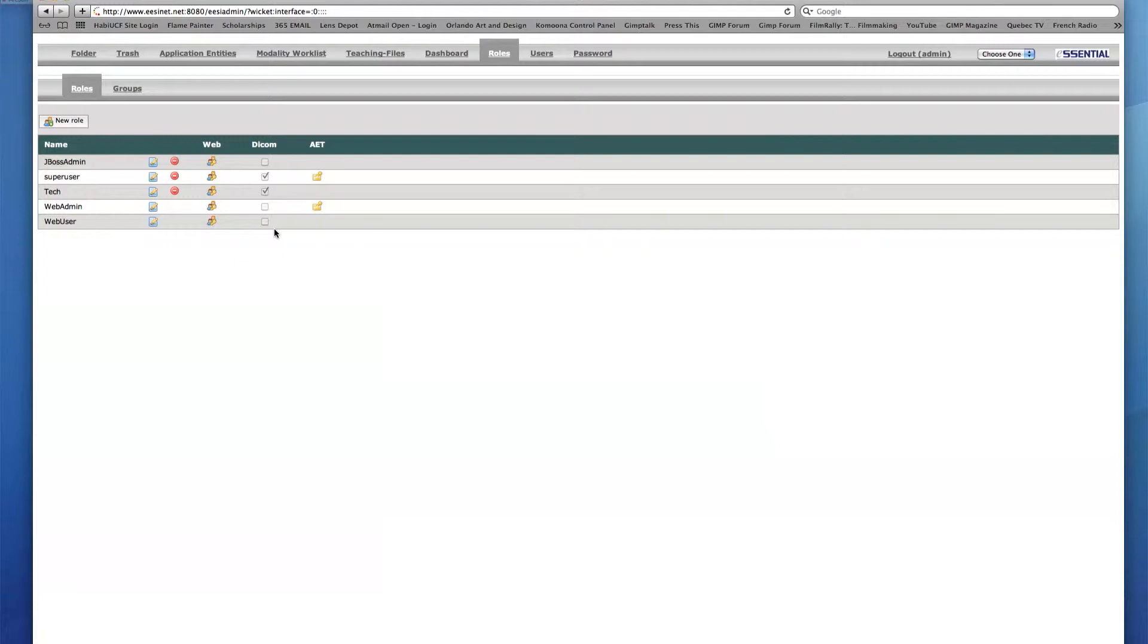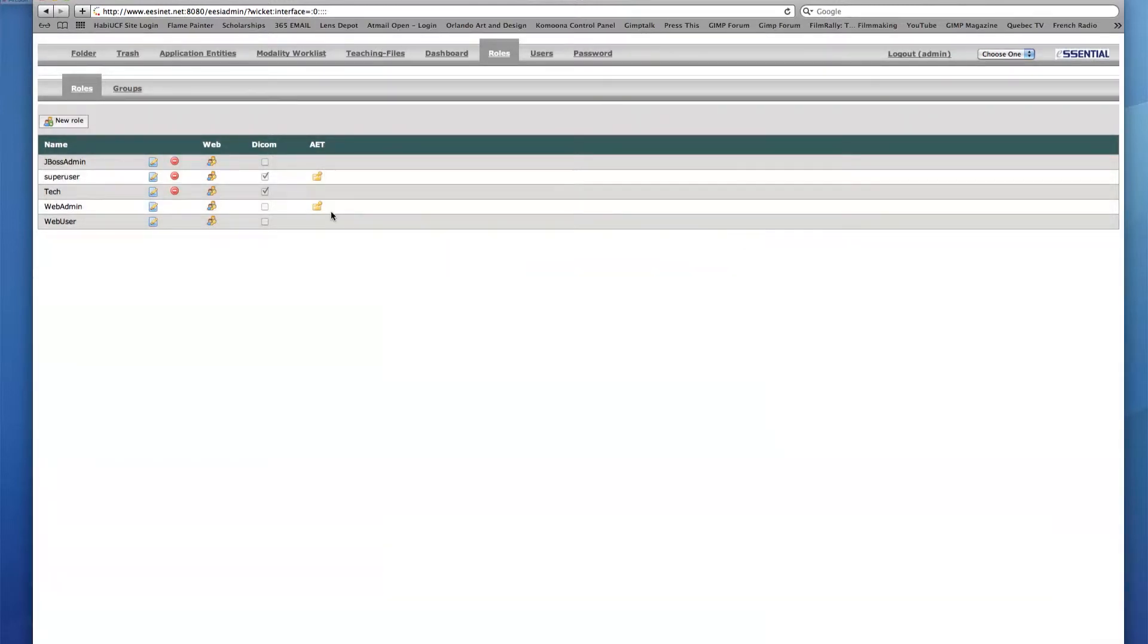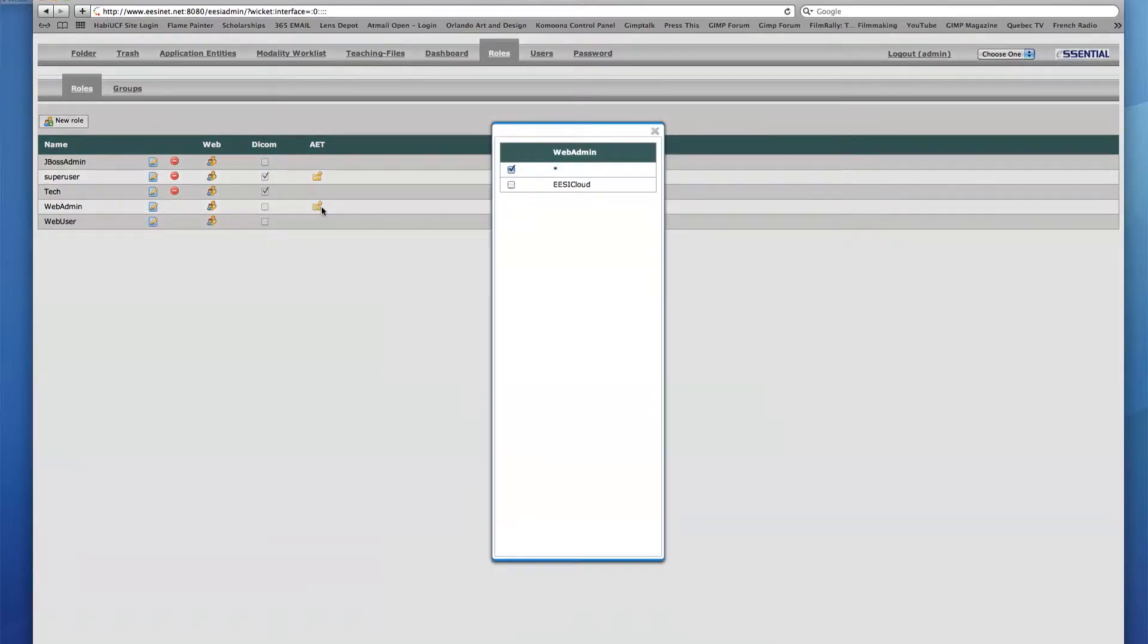Finally, under AET, there are icons in the rows of only a select few of the roles. This indicates that the AET checkbox was enabled in the Edit Roles dialog box, thus giving users with these particular roles the ability to interact with either all application entities or just the application entities specified by the admin. Clicking the icon allows the admin to choose which AET groups the user can interact with.